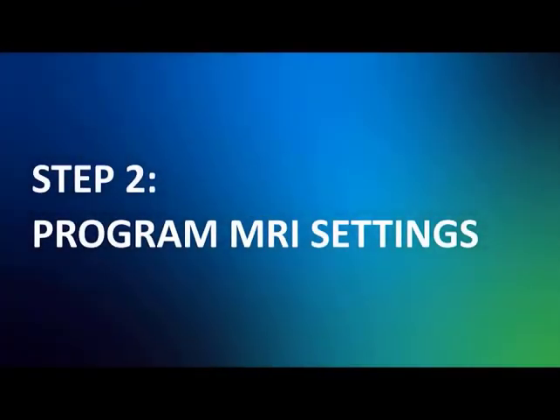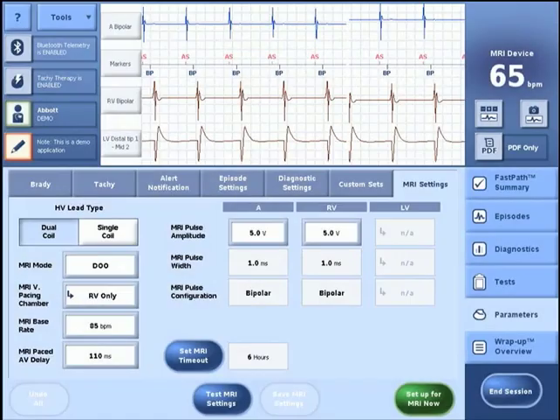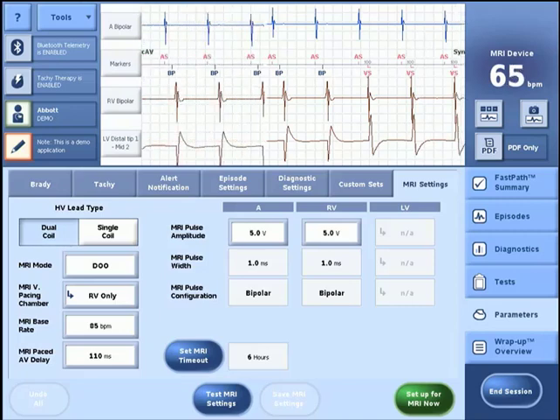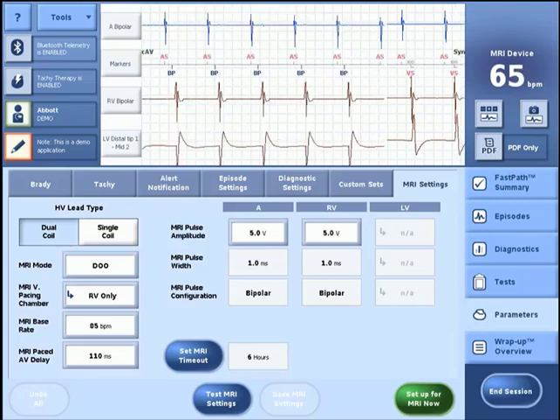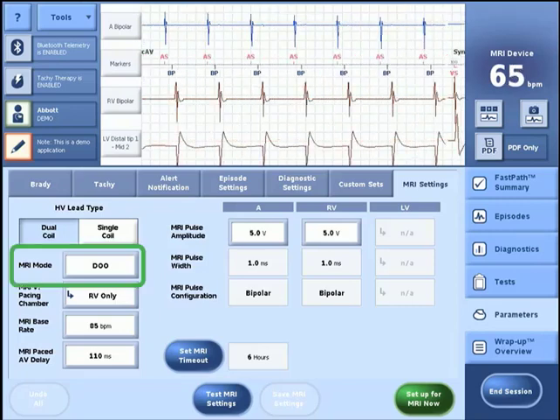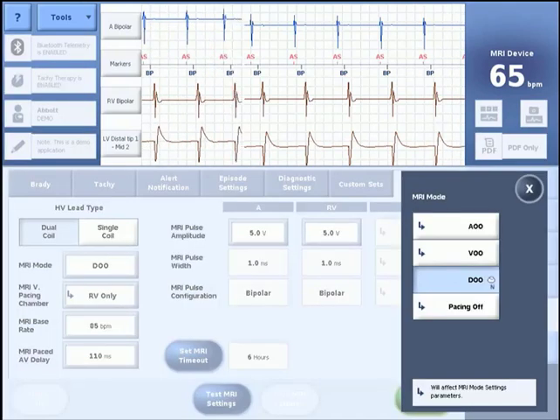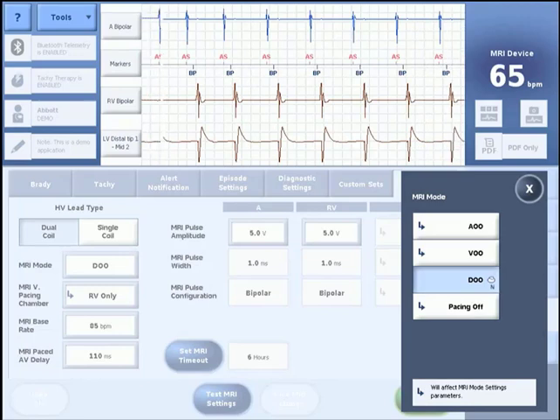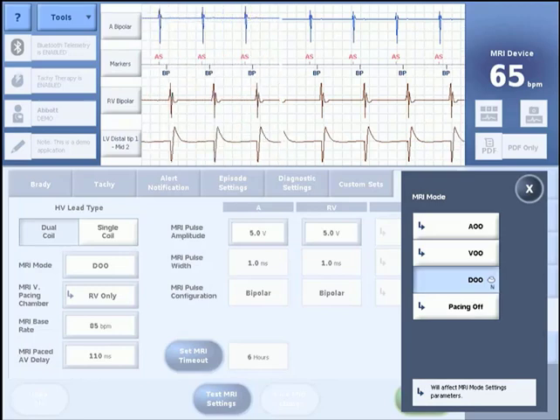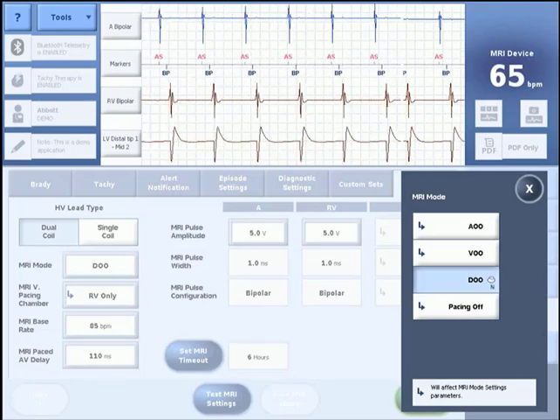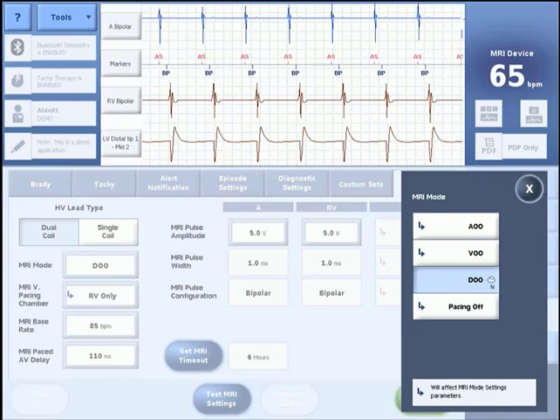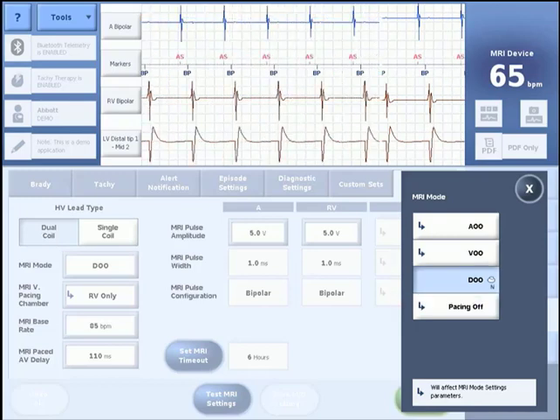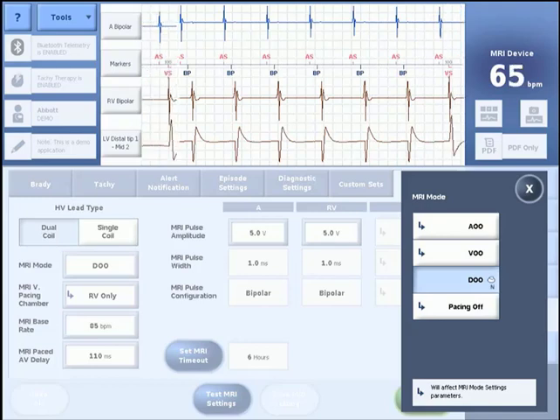Next, on the MRI settings menu, all of the available pacing parameters for programming are visible. The first MRI pacing parameter to address is the pacing mode. For an ICD, the nominal pacing mode is pacing off. If pacing is required, the following asynchronous pacing modes are available. For a CRTD, the nominal pacing mode is DOO. The same pacing modes available in an ICD are also available for CRTDs.